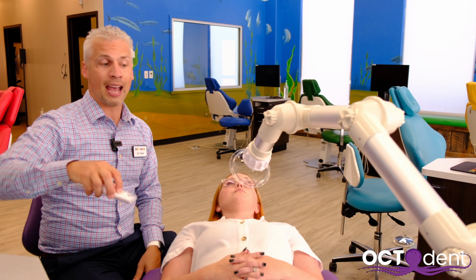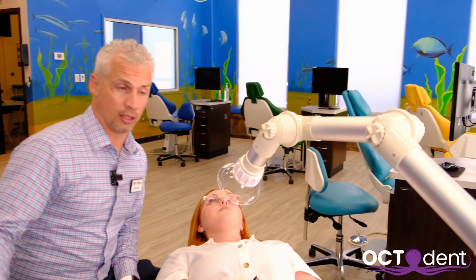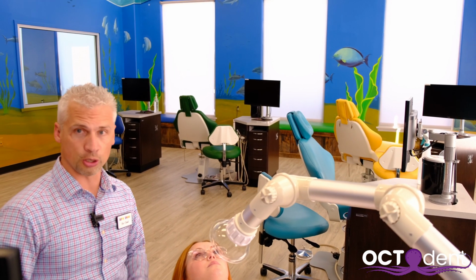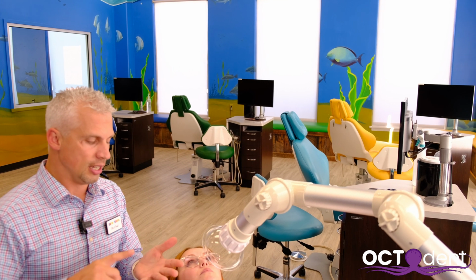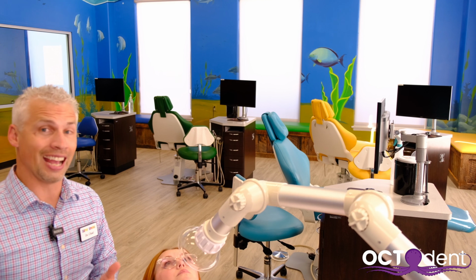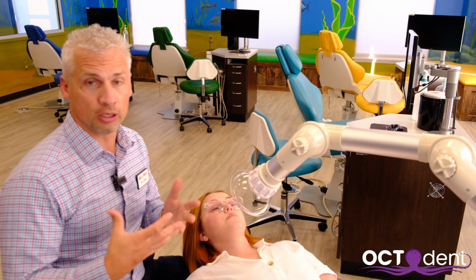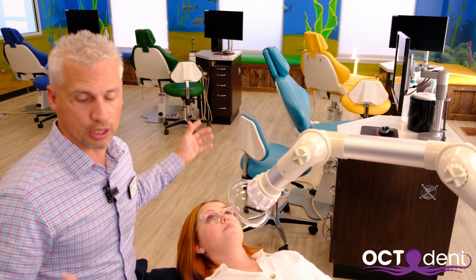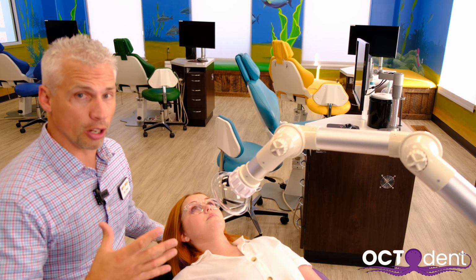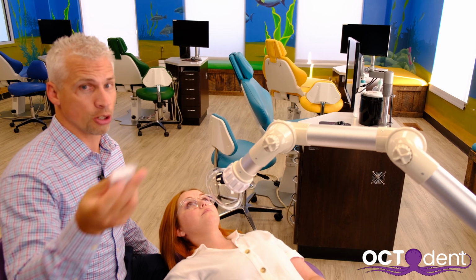So if I have it on level 7, and I'm using my hand speed, I'm using my drills, it's very loud at this point. I've got maybe an intraoral suctioning device, an extraoral suctioning device, and a high speed, high volume drill, and now I've got all this noise. So what's really great is while I'm drilling, I have it on. But while I'm not drilling or not using aerosols, I turn it off.